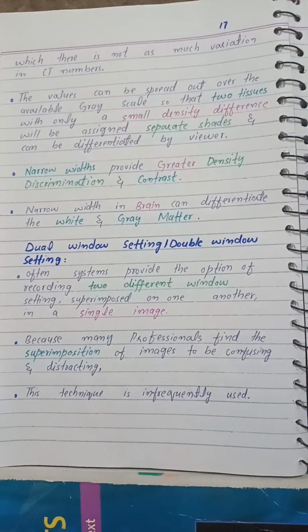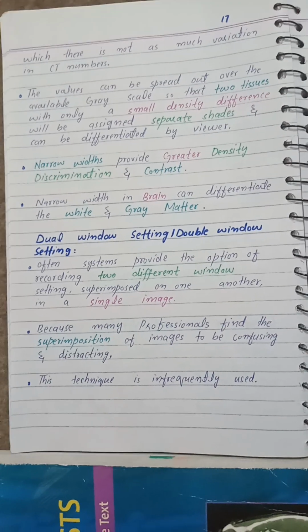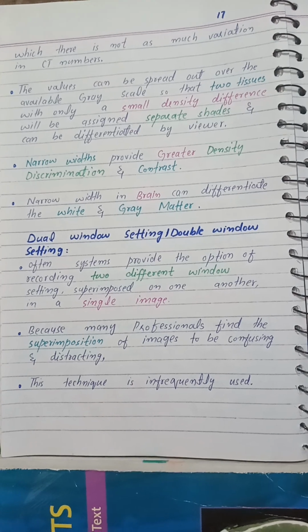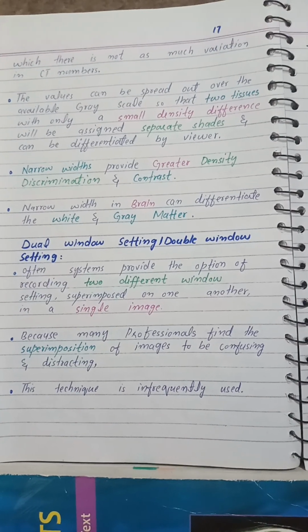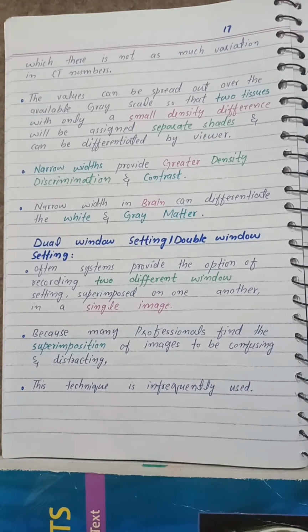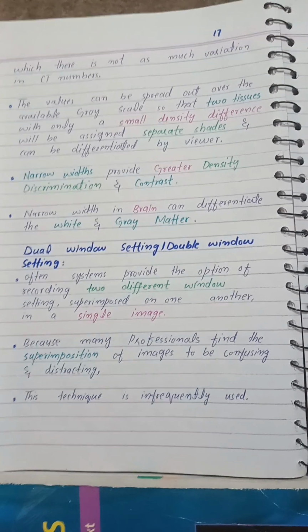Dual window setting, or double window setting. Often systems provide the option of recording two different window settings superimposed on one another in a single image. Because many professionals find the superimposition of images to be confusing and distracting, this technique is infrequently used.